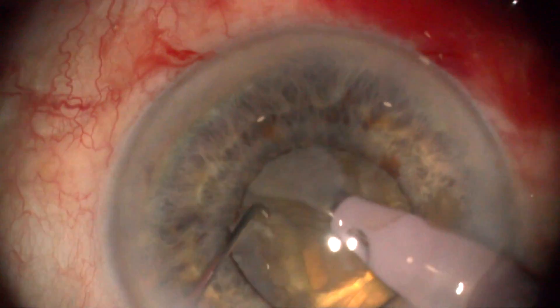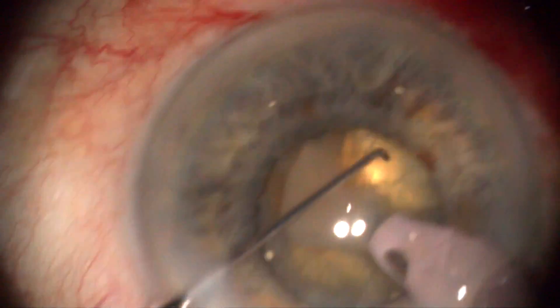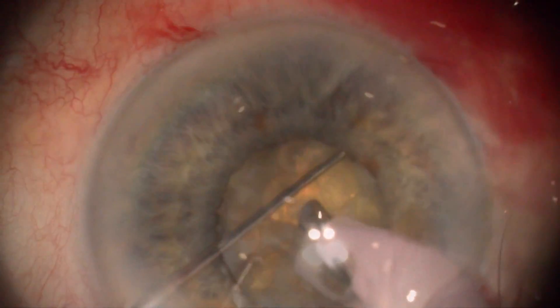We introduce each fragment inside the deep bowl, far from the endothelium. The fragment is close to the leathery posterior plate and protected posterior capsule. The Szynski hook prevents fragment rotation toward the endothelium.